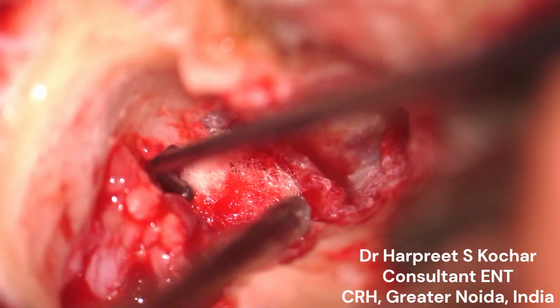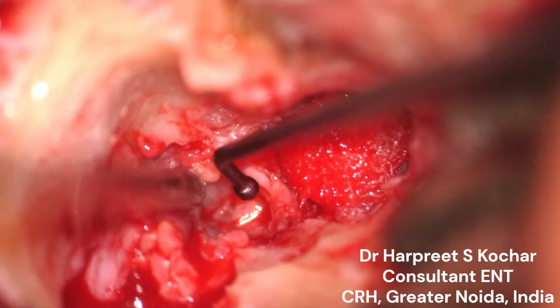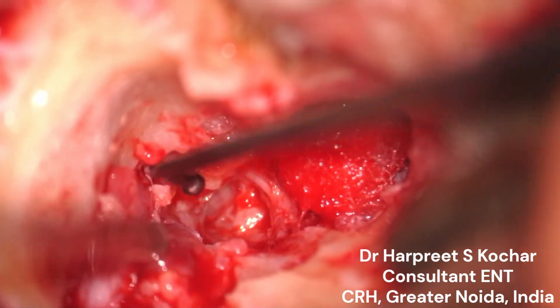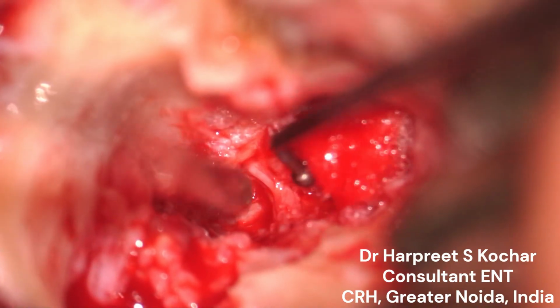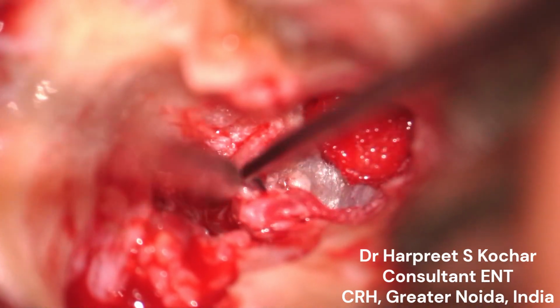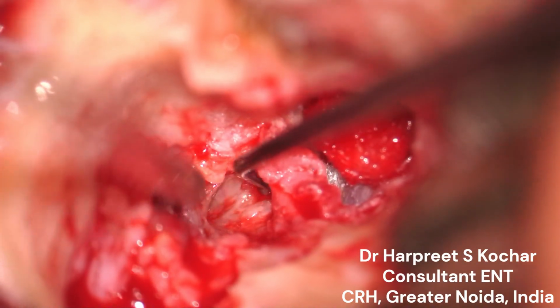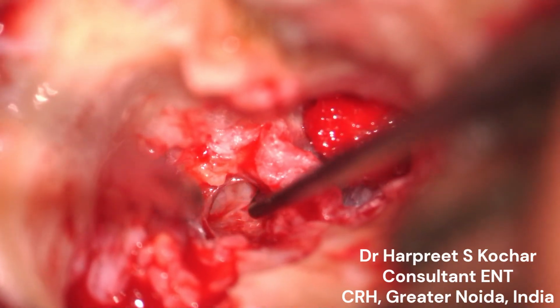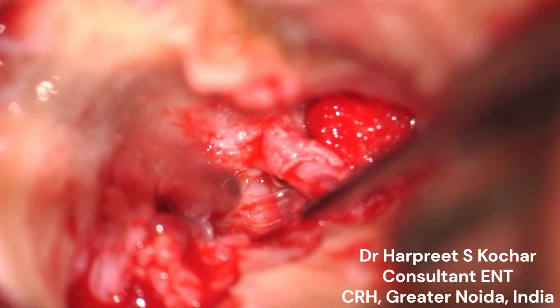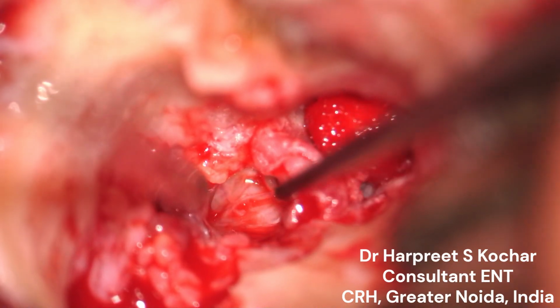This video shows the dissection of cholesteatoma from the area of facial nerve and oval window niche. So this is a right ear and the atticoantrostomy has already been done. By default, all cases of unsafe chronic suppurative otitis media cholesteatoma should be scanned with a CT scan to identify any dehiscence of the facial nerve. Otherwise, also facial nerve dehiscence should be assumed in almost all the cases.